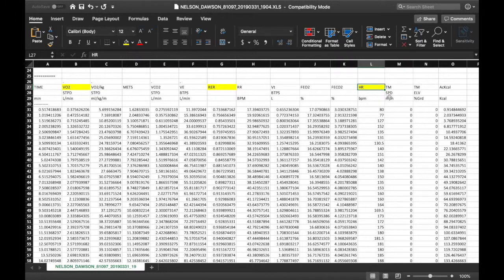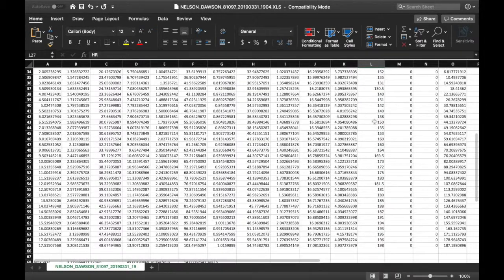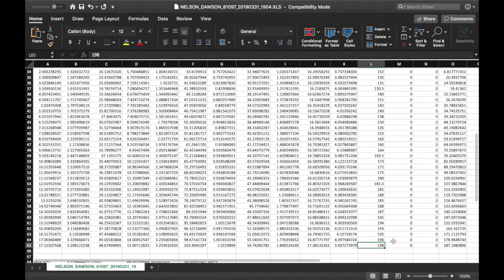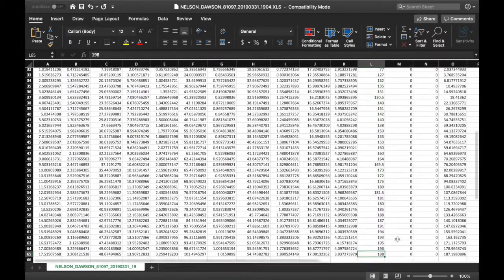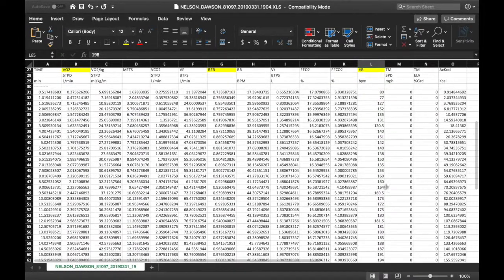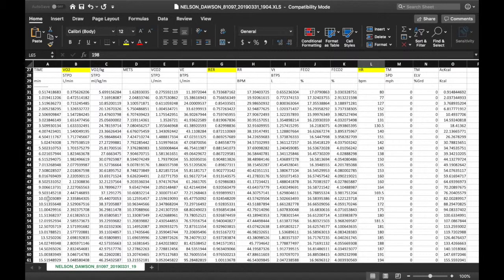Heart rate is really important because it's one of the ways we confirm the validity of the max test. We got Dawson to 198 beats per minute. All these data points are lined up according to time, so it's very easy to see that at 10 minutes into the test, Dawson was at these numbers across the board.